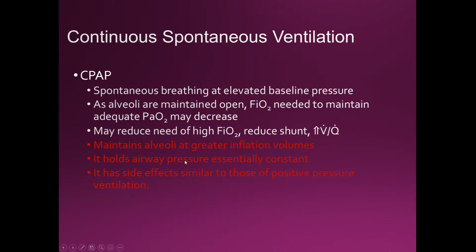CPAP. Now this is where the obstructive sleep apnea should fall under, and I'll probably fix the slide. Again, spontaneous breathing. You need to be spontaneously breathing to recommend CPAP. Please don't put CPAP on someone who is sedated. Don't do it. They are spontaneously breathing, yes, but with sedation, they are breathing less. And this is not going to help them breathe even more.